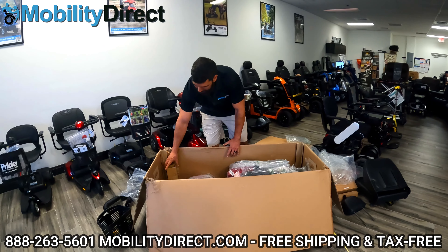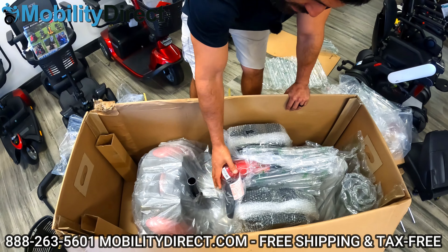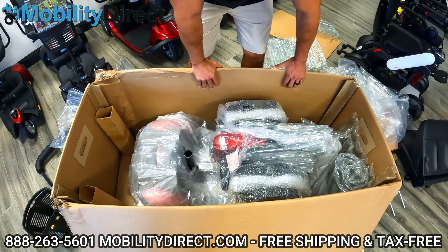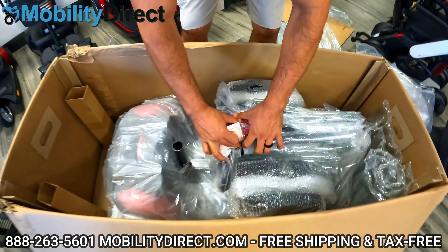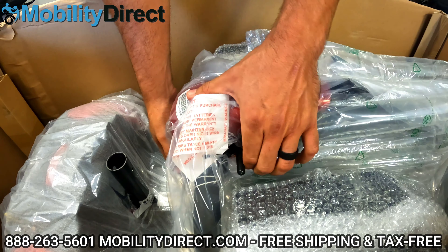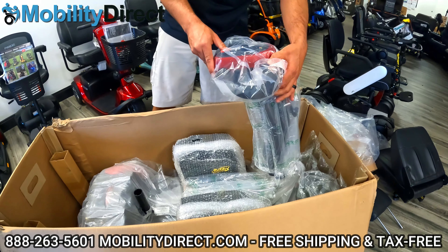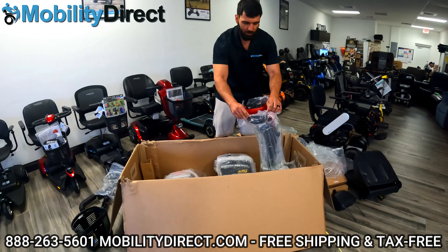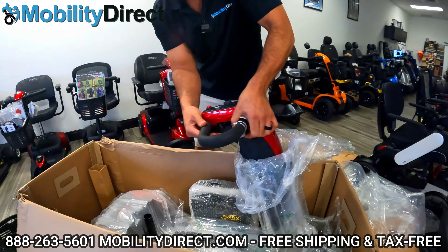There's a lot of bubble wrap and excess cardboard, which is important — you definitely want the unit to be protected. The handlebar assembly — the tiller is the technical term — needs to be raised up so we can get the battery out of the base. There's a lever right here. You need to give it some action and you can see it wiggles upwards toward the handlebar. Pull it up and raise the handlebar all the way. That's the release lever, and it can also be used to tilt the tiller closer to or further away from you.